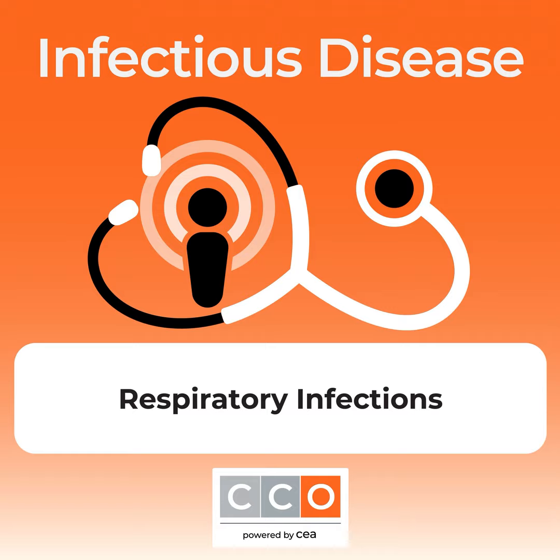Now, what did it lead to? That's nice about detecting more organisms or detecting them faster, but how did that translate to outcomes for patients in regards to antibiotic prescribing? And what you can see here is that for gram-positive bacteria that were detected by the panel, that led to faster escalation and de-escalation. And primarily that's related to vancomycin for MRSA coverage.